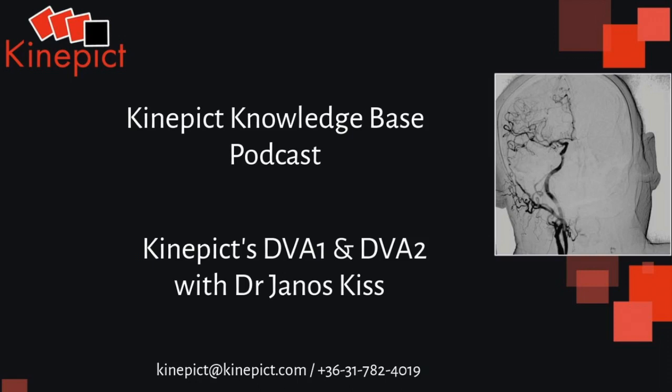For example, one of the major benefits of the DVA technology is dose management, which means that the quality reserve or the excess quality of the DVA angiograms allows the reduction of radiation dose or contrast agent amount. However, under these conditions, the acquired image is not as good in quality as under normal conditions, when we obtain the image with a full dose protocol.